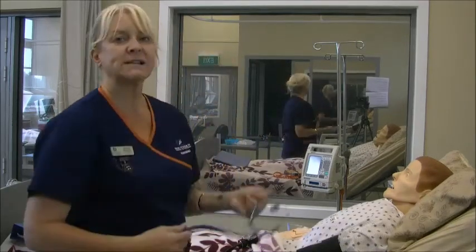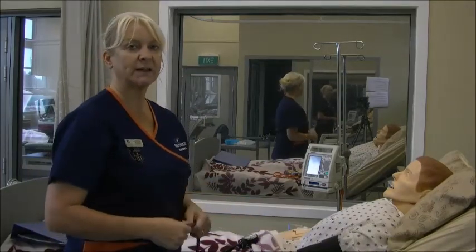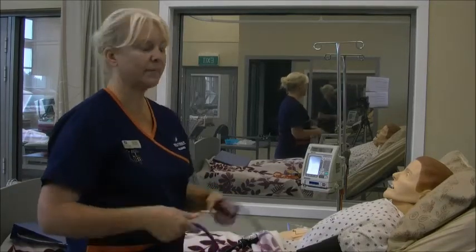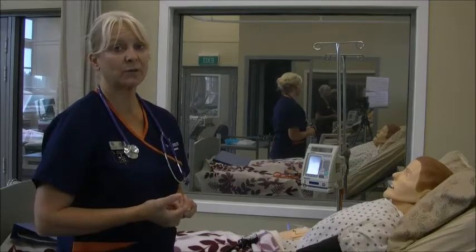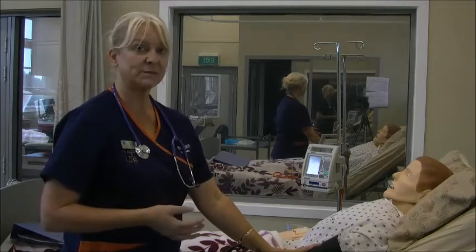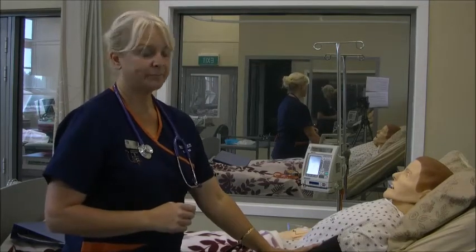At this point in the assessment, you are probably wondering why I'm using a mannequin and I won't be able to get his blood pressure or his pulse in actually what they are. So when you're working with your tutor, you will ask her for what the results are. So now that I've checked the blood pressure, I can ask the tutor what was his blood pressure. So she's going to tell me that it's 100/50.